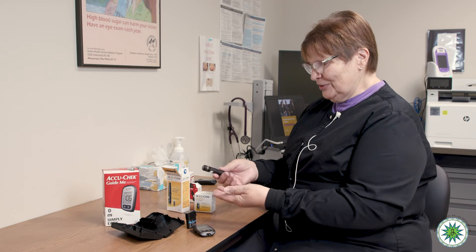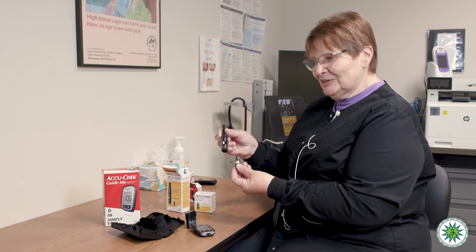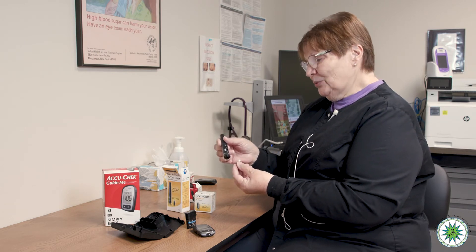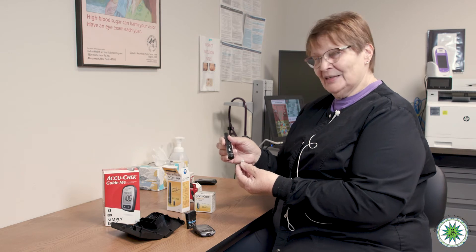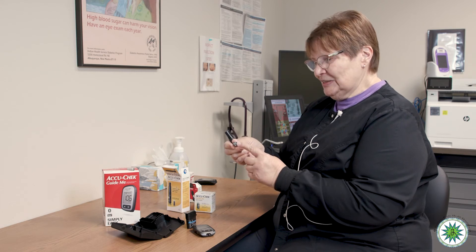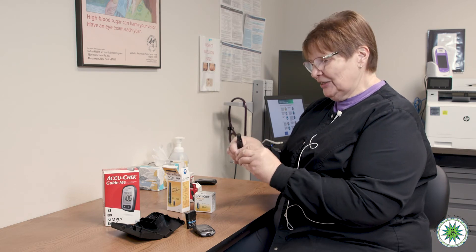Sometimes people get home and think it should be straightforward to figure out, but we've had different devices over time, so this is the one we currently have. It's also one we prefer because it has less risk of re-sticking. All the lancets are self-enclosed into this little drum casing, and there are six individual new lancets in here.